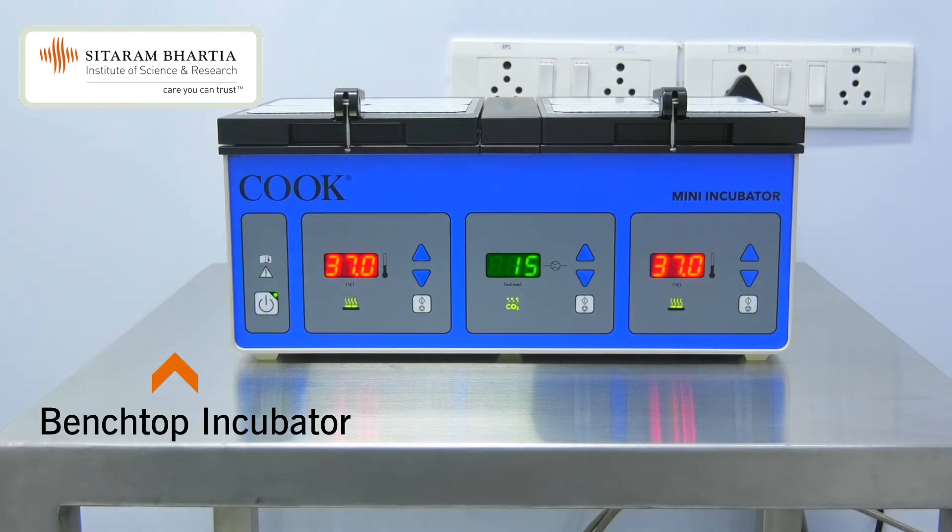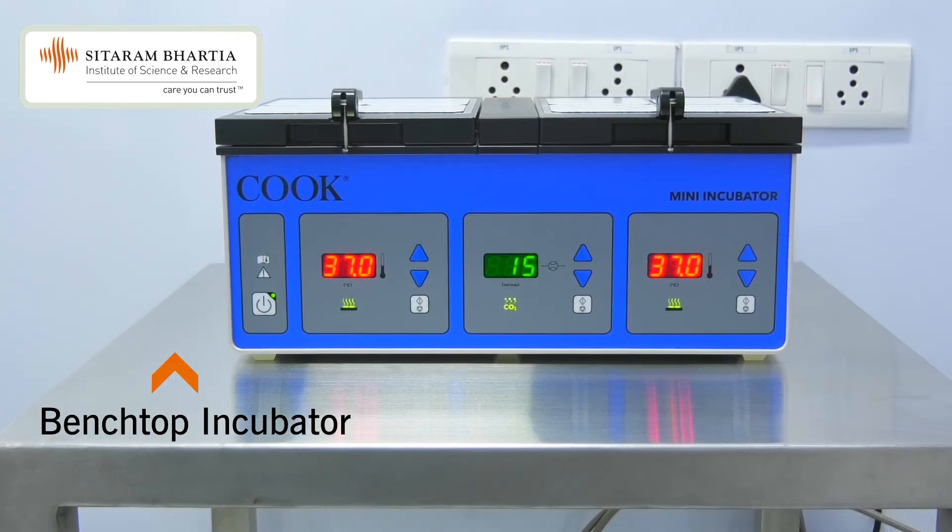This is Mink, a kind of benchtop incubator. We generally use this equipment for the culture of our embryos and for the blastocyst culture.